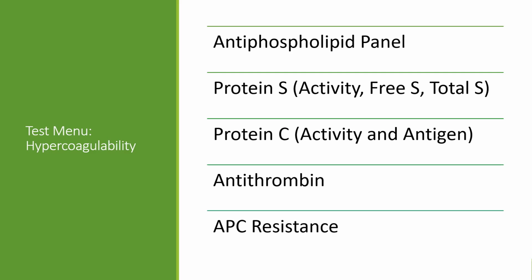Okay. Now we are going to look at our hypercoagulability test menu. So this is a little different. These are things that are going to be associated with malfunction of our regulatory system, our fibrinolytic system.